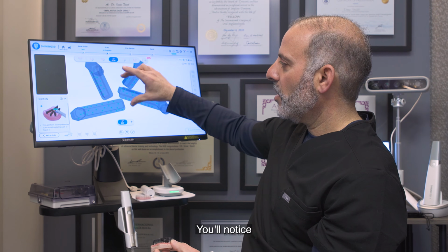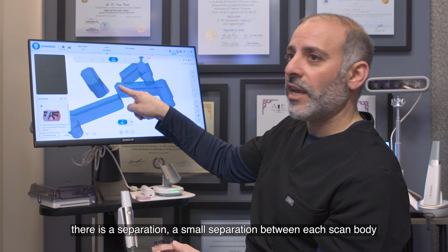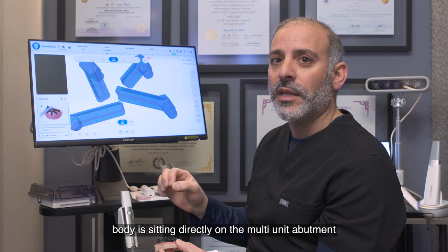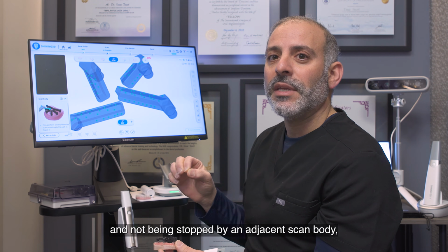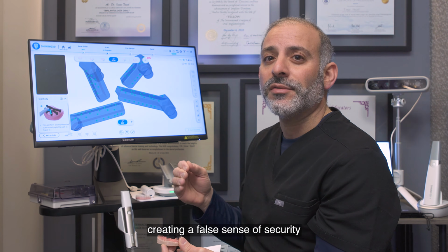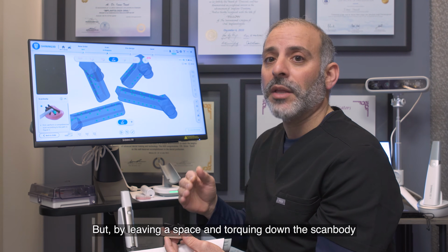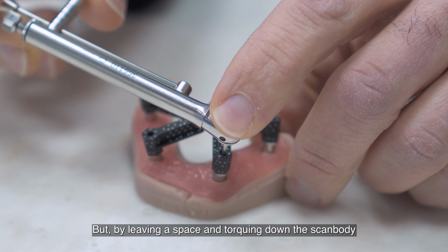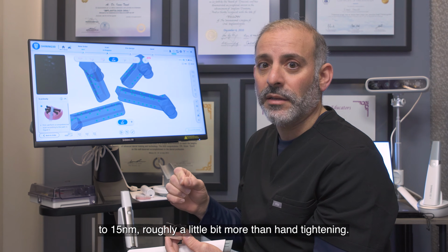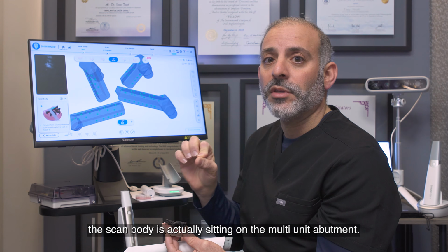You'll notice there is a small separation between each scan body so that we can ensure when installed the scan body is sitting directly on the multi-unit abutment and not being stopped by an adjacent scan body, creating a false sense of security that the scan body is actually screwed down into the multi-unit abutment. But by leaving a space and torquing down the scan body to 15 newtons, roughly a little bit more than hand tightening, we are able to ensure that now the scan body is actually sitting on the multi-unit abutment.